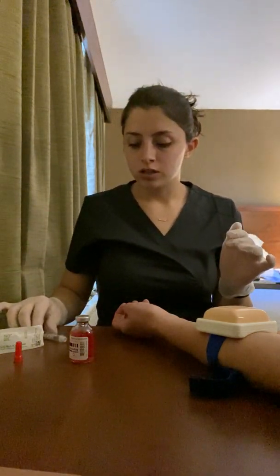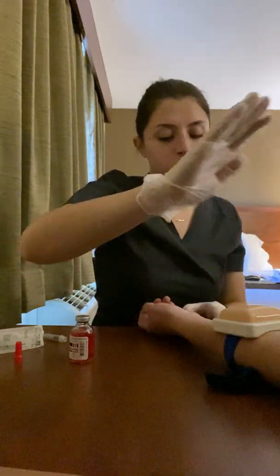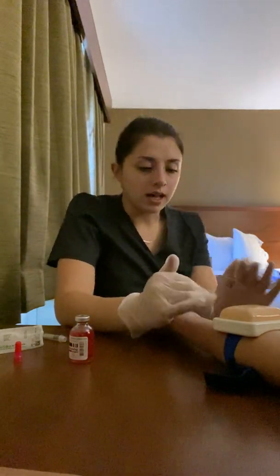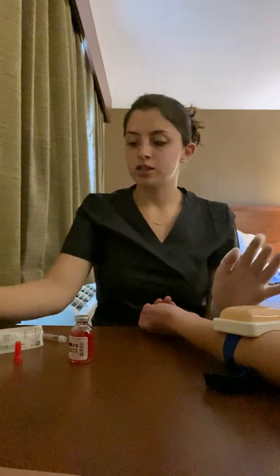Now I'm going to inspect the area, so it's going to be 3 to 4 finger widths below the antecubital space and a hand width above the wrist. The site has no lesions or skin discoloration. I'm going to palpate for tenderness. Is it tender? Nope. Okay, so the site is good to use.